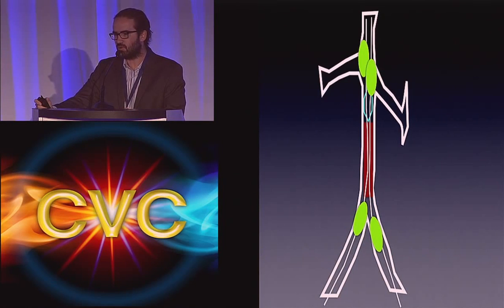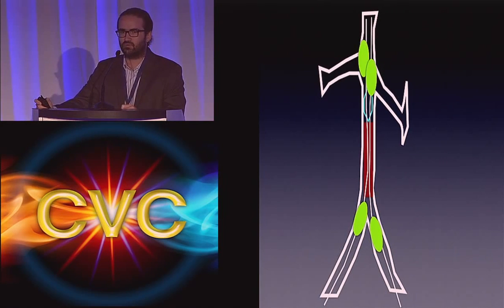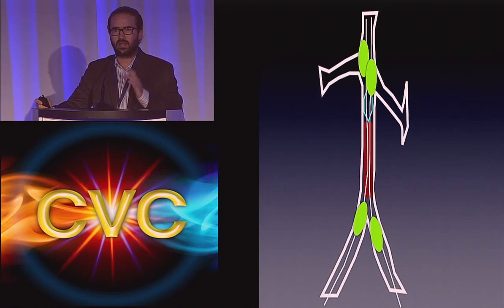Now, one of the early criticisms that we got was that we were told that could be crazy. What happens if one of the wires would hook onto the IVC filter and then you're stuck in a worse place? Well, it would really have to be hard, because most of these IVC filters have been placed there for a while, so they are well incorporated into the wall. And the other thing is that this wire does not rotate, so it's not going to catch in any way. It's not like a swinging rope. It rather just oscillates back and forth.